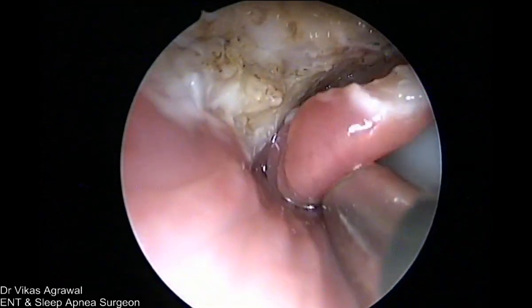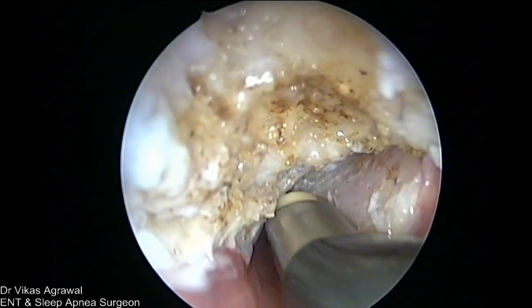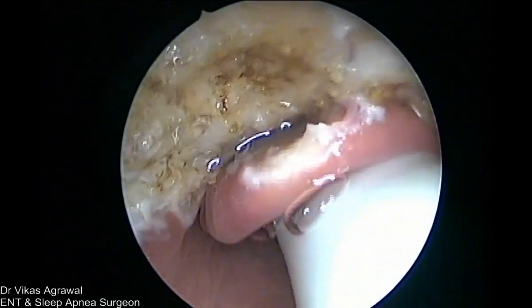Now see, if you ablate mucosa, you will strip the perichondrium. It is only coagulation. The perichondrium is not lost, so there will be no perichondritis, epiglottitis, and various other things.